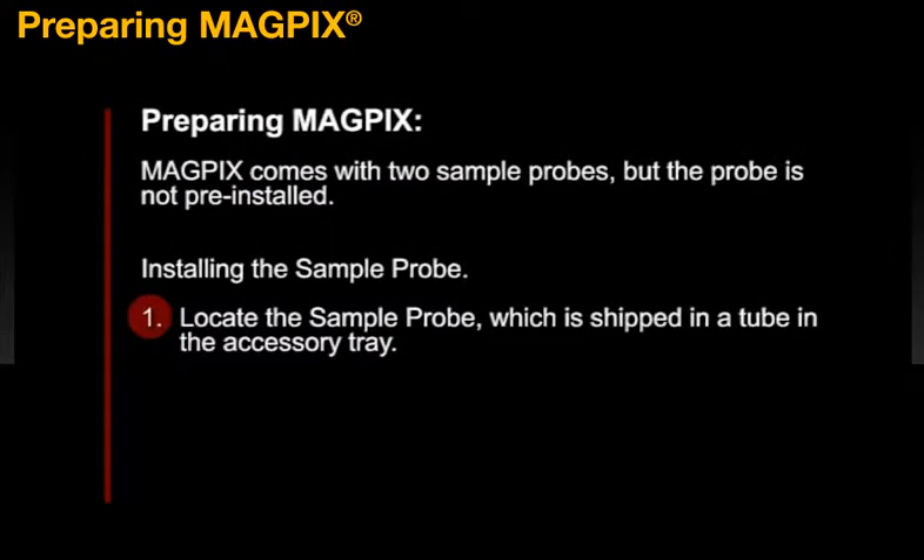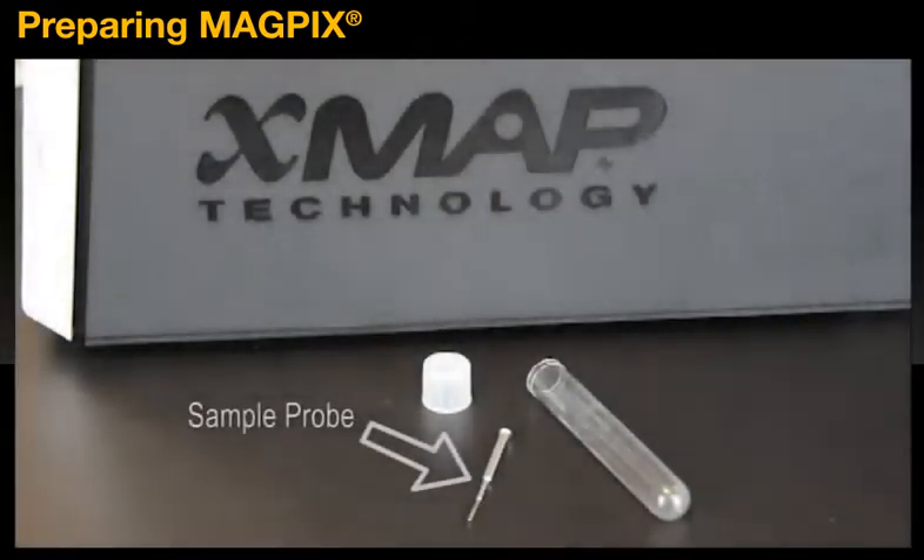MagPix comes with two sample probes, but the probe is not pre-installed. To install the sample probe, first locate the sample probe, which is shipped in a tube in the accessory tray.